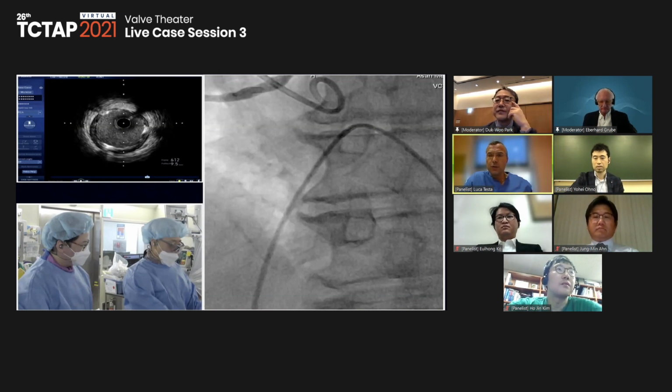In other words, we do everything in just one shot. Of course, it depends on the availability of the specific software and devices. If you don't have a high-speed CT scan, it sometimes can be impossible. But in terms of a pre-workup, it would be great to have all the information you need in one shot. And I must say that I totally agree with you.